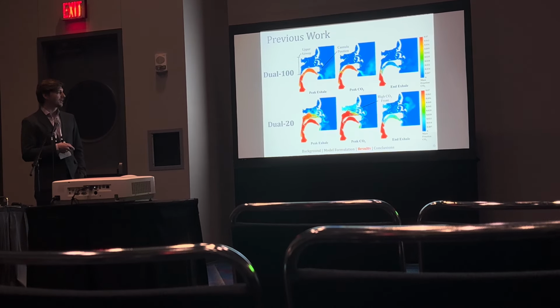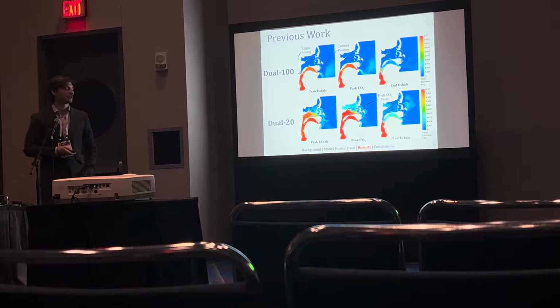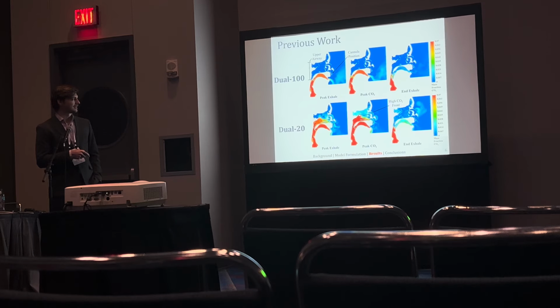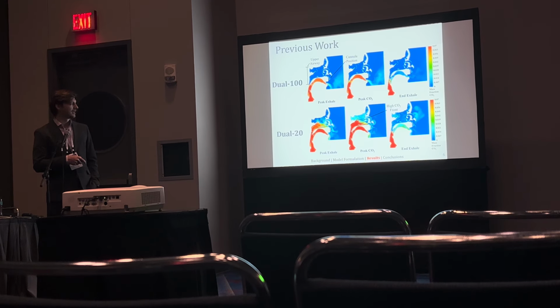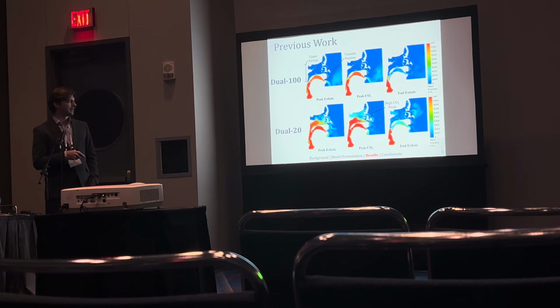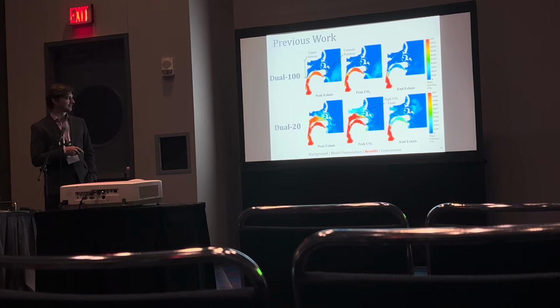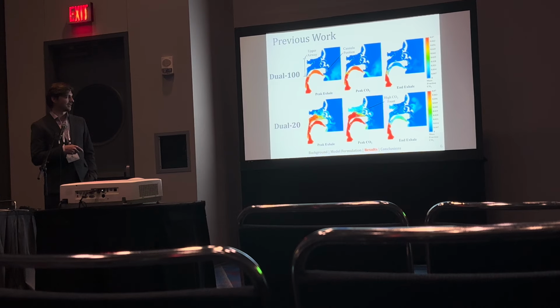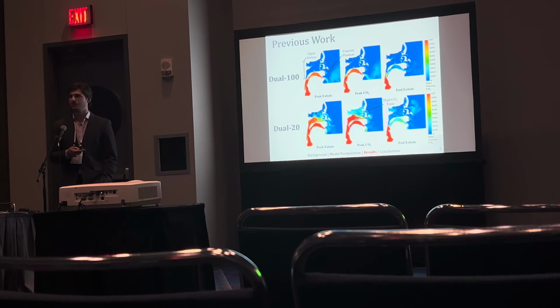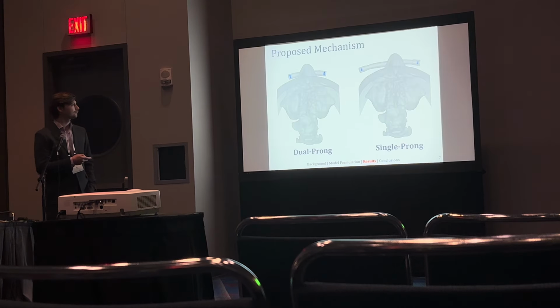But if we close the mouth to 20% open, so this was our intermediate difficulty flush scenario, we see significantly more CO2 entrainment, and then this high CO2 front where we have expiratory flow breaching the uppermost portions of the airway, and then the therapy flow combating that, and you create almost like this stagnation region back here and this front. And then by end exhale, there's a higher CO2 entrainment, so the simulated patient is likely to re-inhale more CO2.